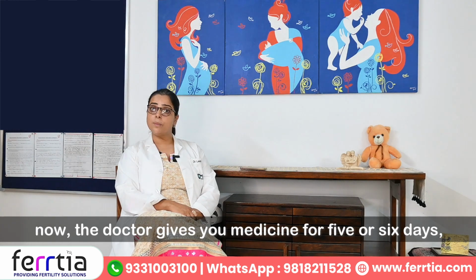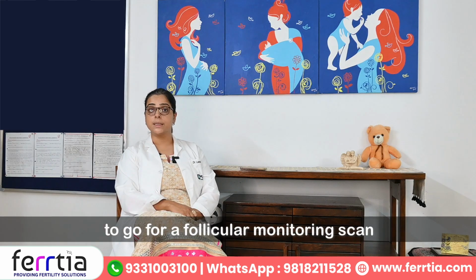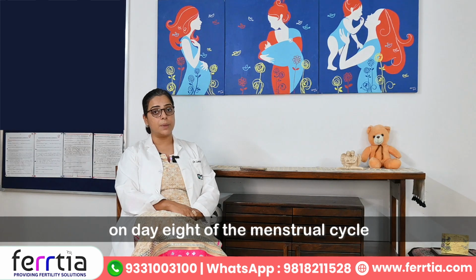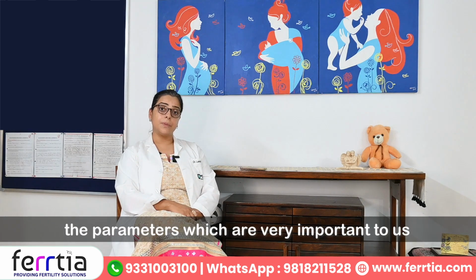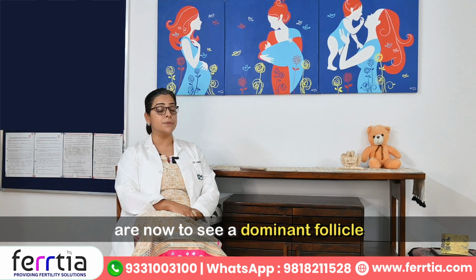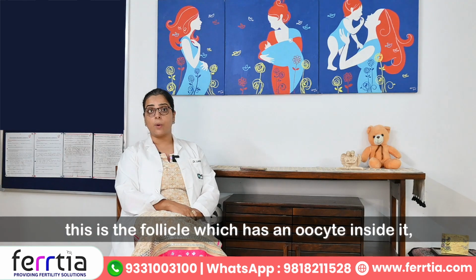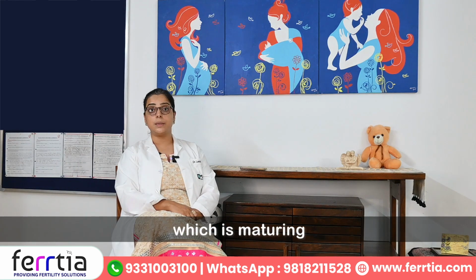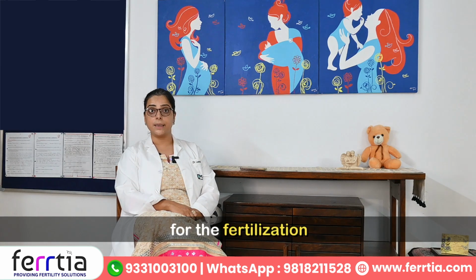Now the doctor gives you medicine for 5 or 6 days, and again the doctor tells you to go for a follicular monitoring scan on day 8 of the menstrual cycle. When we do a scan on day 8 of the menstrual cycle, the parameters which are very important to us are now to see a dominant follicle. By dominant follicle, I mean that this is the follicle which has an oocyte inside it, which is maturing and which will be available for us for the fertilization.